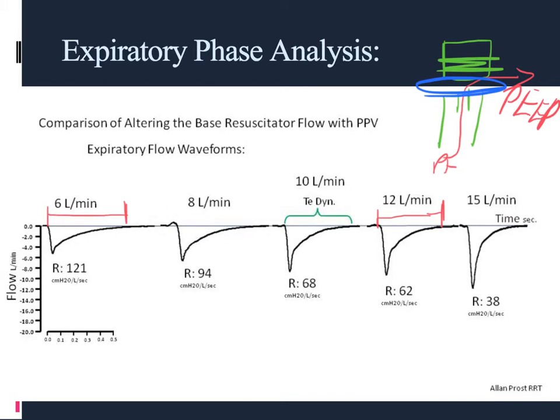If you're ventilating at higher rates, you could very well be causing some air trapping and some auto-PEEP within your patient. At the higher flow rates, such as 12 or 15 liters per minute, the time it takes to get equilibrium between mouth pressures and circuit pressures or lung pressures is dramatically reduced. So your TE, your expiratory time, is dramatically reduced. That's a consideration, and one that may alter your view on what kinds of flow rates you want to use with your NeoPuff.